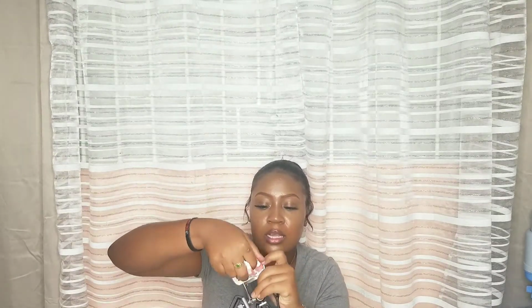So the top and the bottom come out in 3 pieces, as you guys can see, and they have one where everything would come out as one. That one gum is soft. I'm referring to the gingival, which is this pink area. The gum area is soft. This one is the hard gingival.